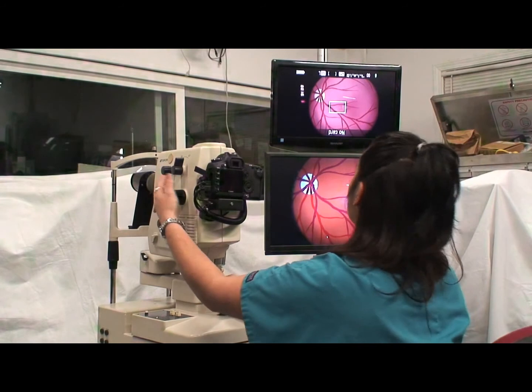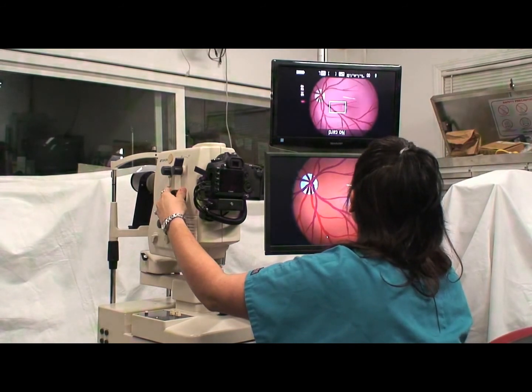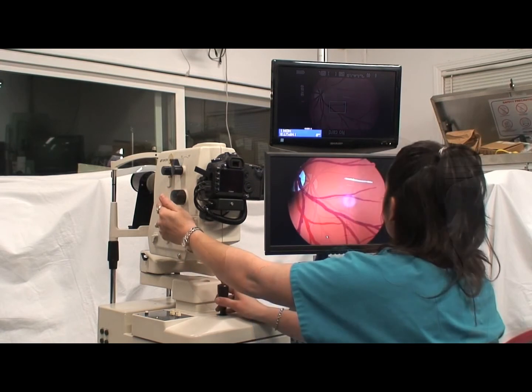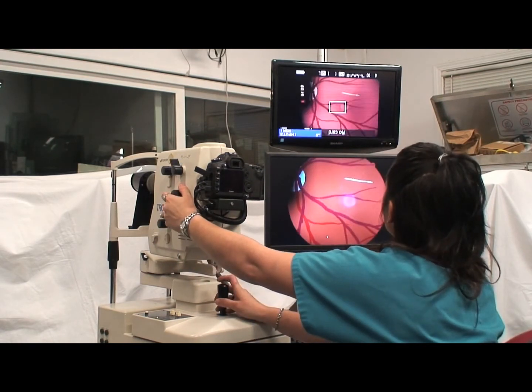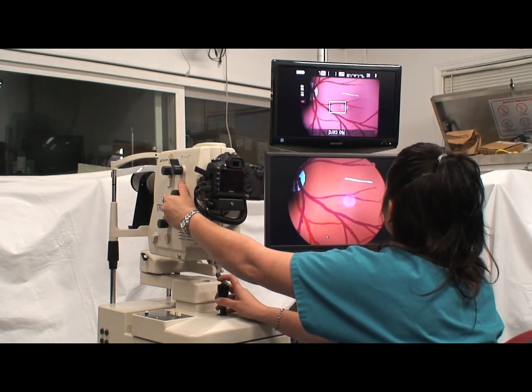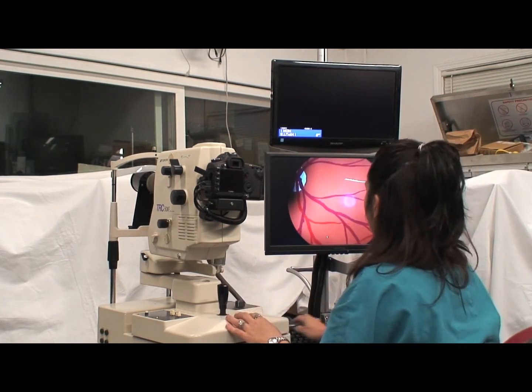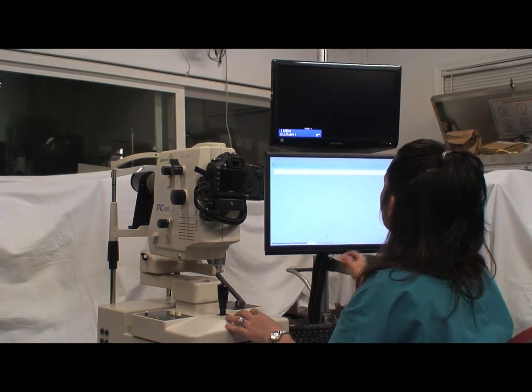You can now focus the retinal camera on the high definition TV screen. Note the exciter filter must be in the out position to view the eye while doing FAs. Click on the escape button on the keyboard to dump all images into the patient's medical record.